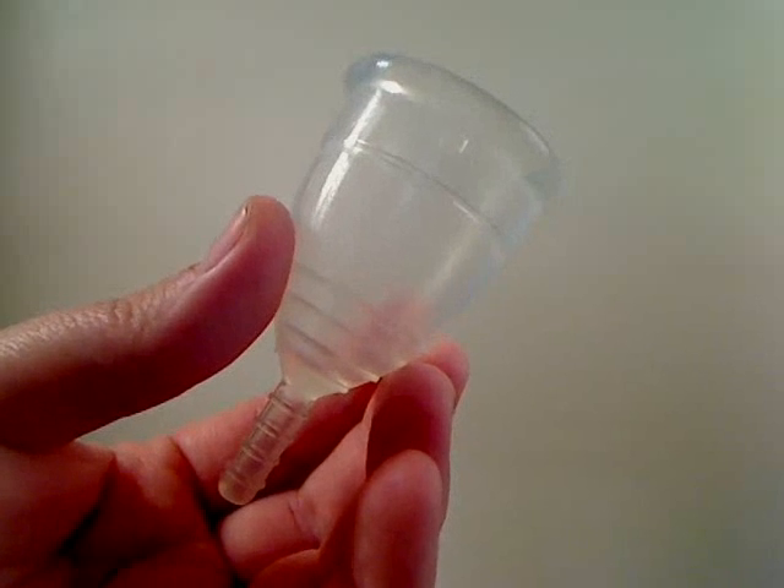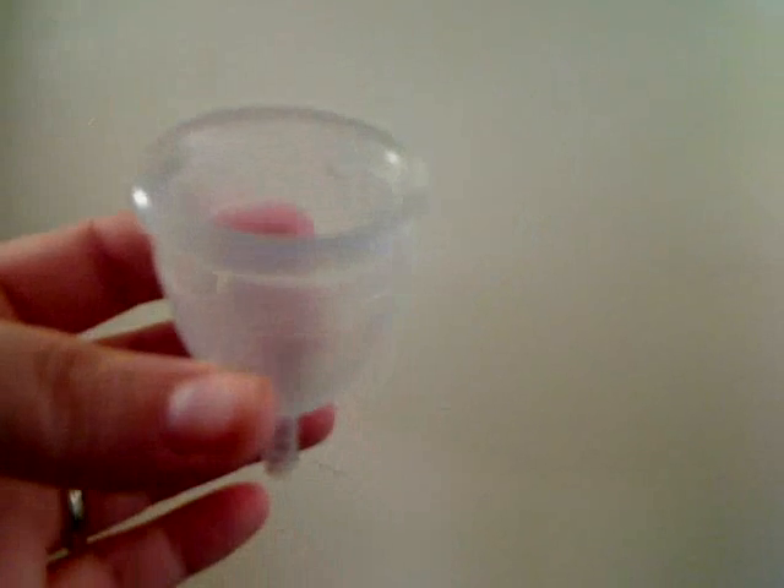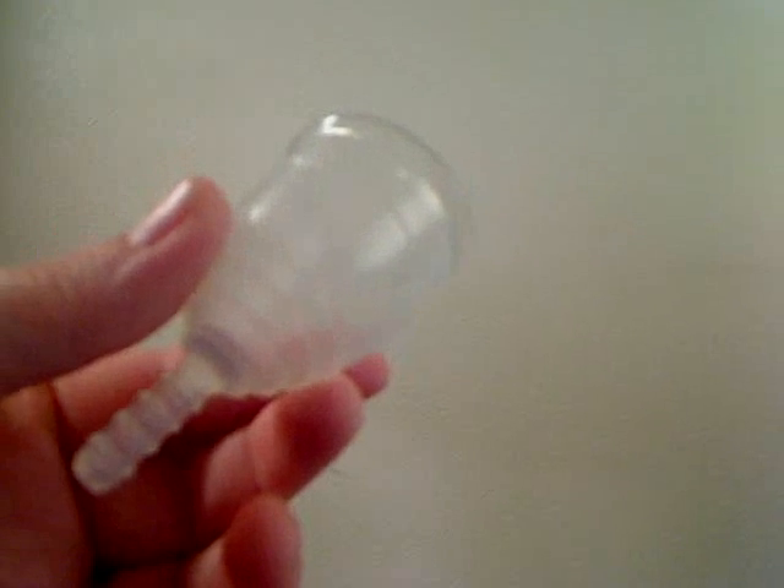It will be nice and clean after you wash it — the blood comes off, so it's not like you're putting old stuff back inside of you or anything.